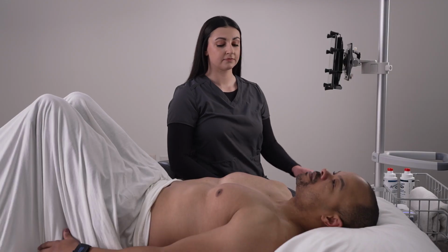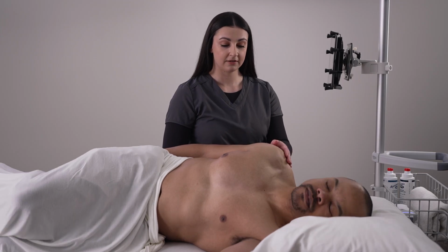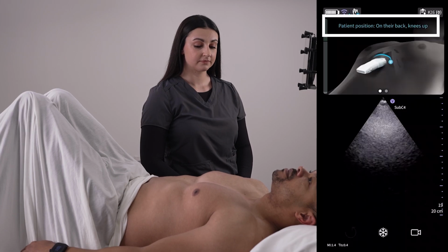It is best practice to scan parasternal and apical views with the patient positioned on their left side with their left arm over their head. However, this may not always be possible, and images for these views can be acquired with the patient lying flat on their back. For the subcostal window, the patient should lie on their back with their knees bent up, if possible.